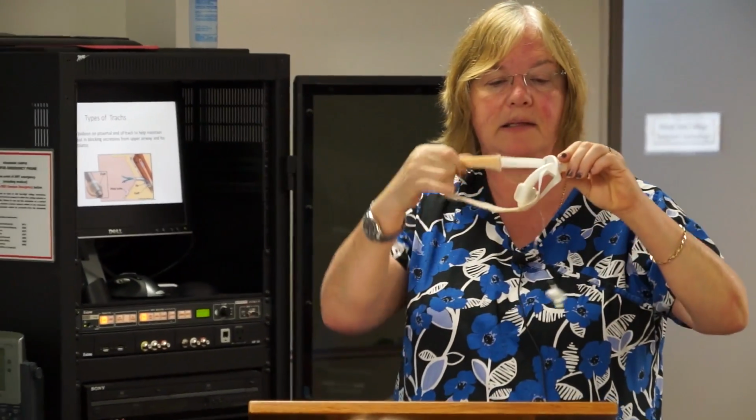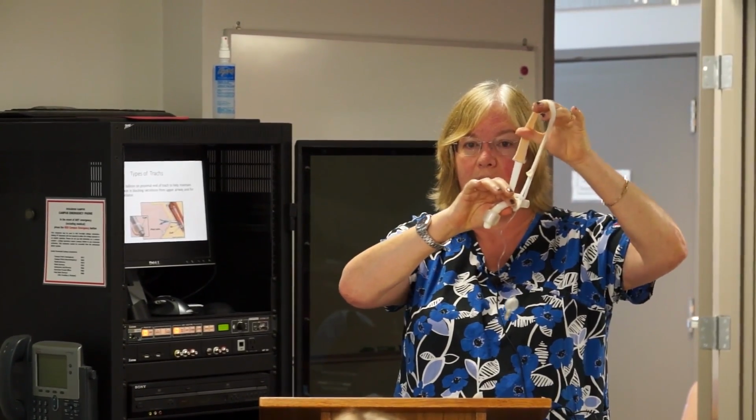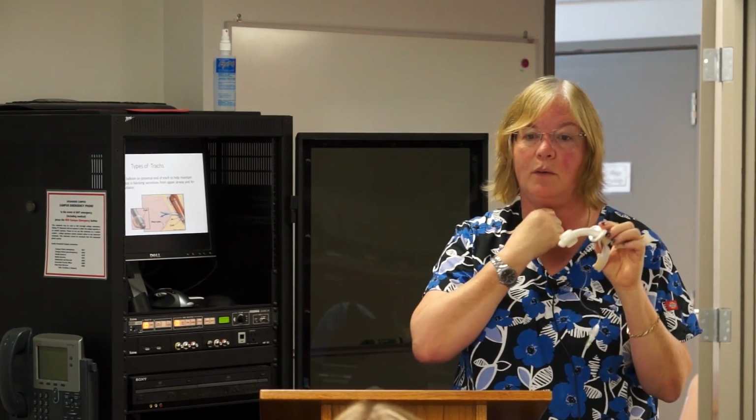Okay, and I say that we want this to help keep the trach in place. The thing that's keeping the trach in place are these ties. The balloon is not meant to keep the trach inside the trachea, because if we put too much pressure on this, it will cause erosion to the side walls of the trachea, and our patient can develop a fistula.